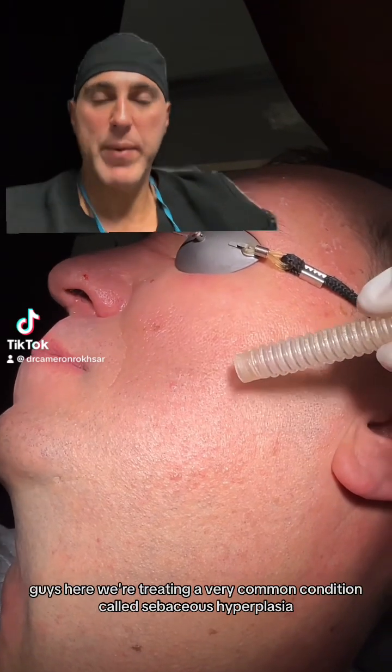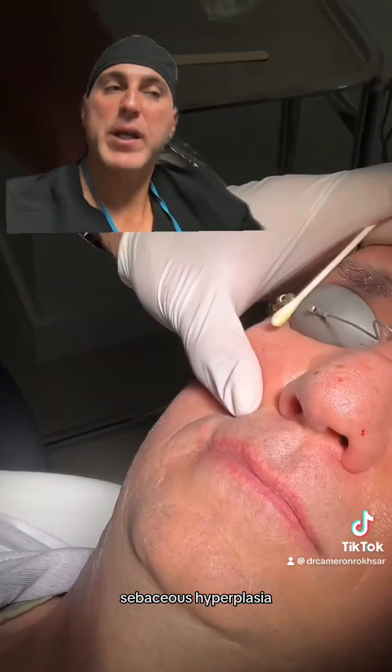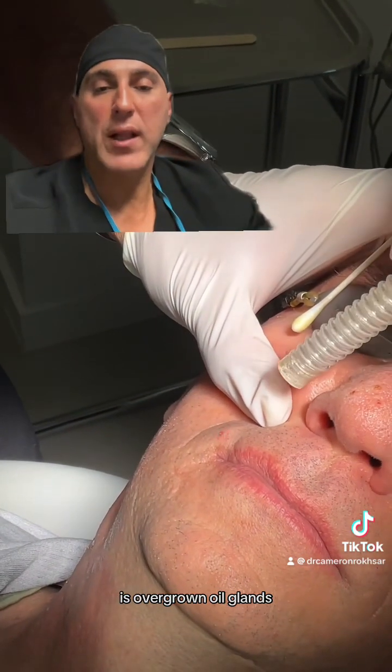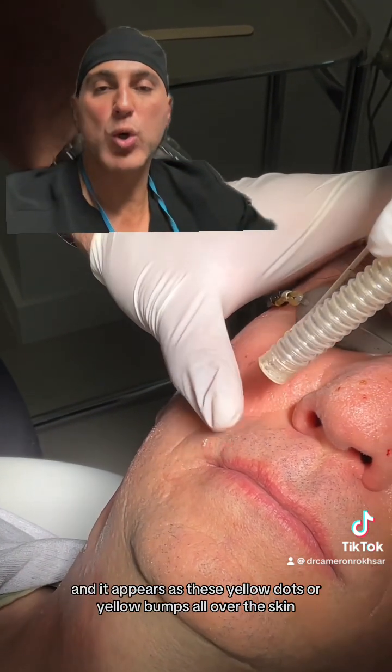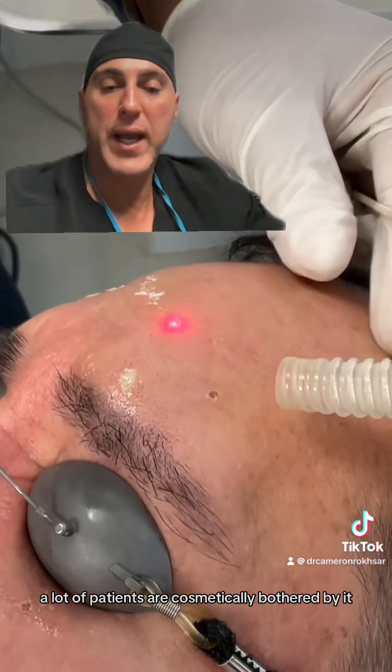Here we're treating a very common condition called sebaceous hyperplasia. Sebaceous hyperplasia is overgrown oil glands and it appears as these yellow dots or yellow bumps all over the skin. A lot of patients are cosmetically bothered by it.